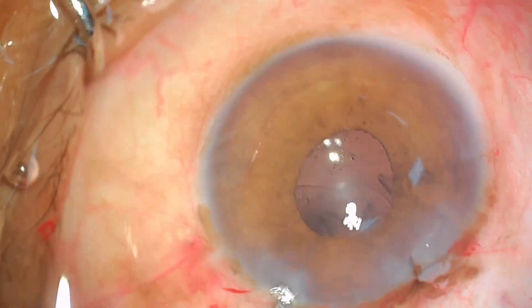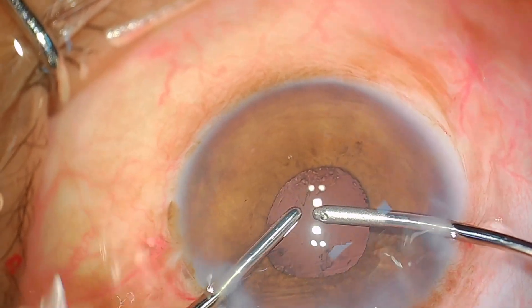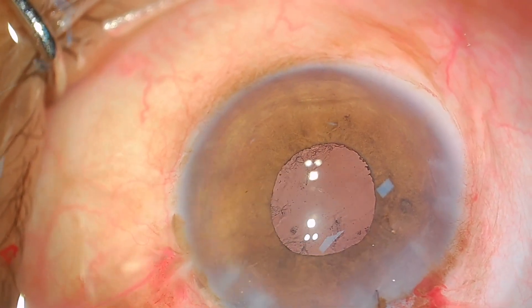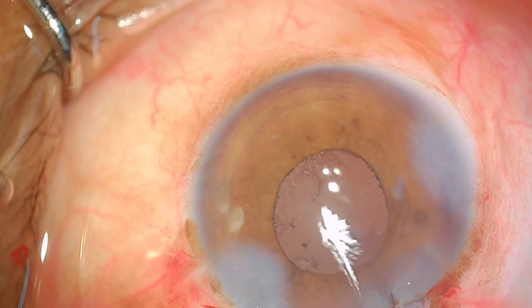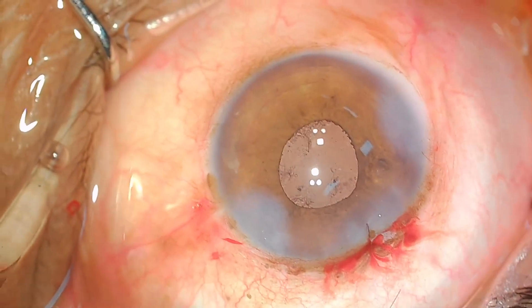Proceed to do a bimanual irrigation to remove the viscoelastic. Please remember to push the IOL once or twice backwards, because there could be some retained sodium hyaluronate behind the IOL which may not come out very easily. Hydrate your wounds and you are ready to go. I hope you liked the video — thank you.